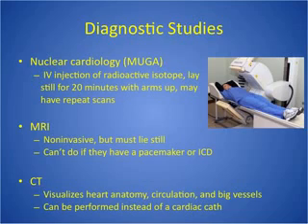So typically they've got to lay still in the machine like you see here on the right with their arms up over their head, and then they may have repeat scans of that.